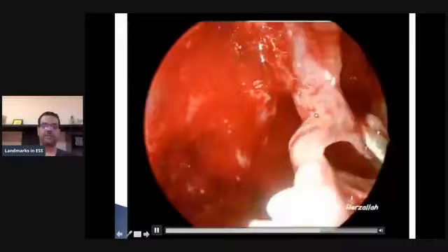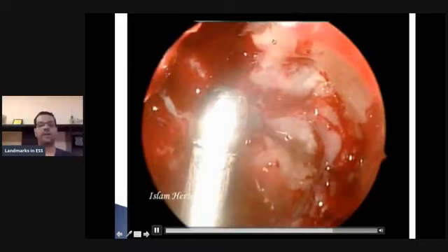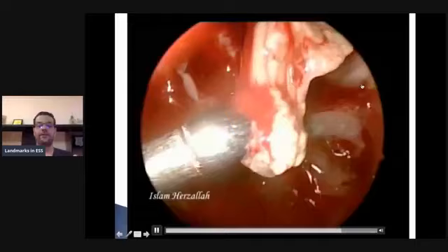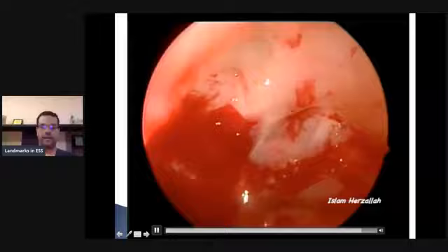And now I'm clearing, taking down the septum again, and I know I'm pretty close to the dehiscent optic and the dehiscent carotid artery. You see this allergic mucin pressing on the optic nerve up there, with so much pressure from the disease the patient had. And then this was all cleared out. I'm going to show you the postoperative picture for the patient. Can you see the pulsations of the dura here, of the sella, the pulsations of the ICA and the optic nerve? I'm going to show you the postoperative result, which shows clearly what you had.